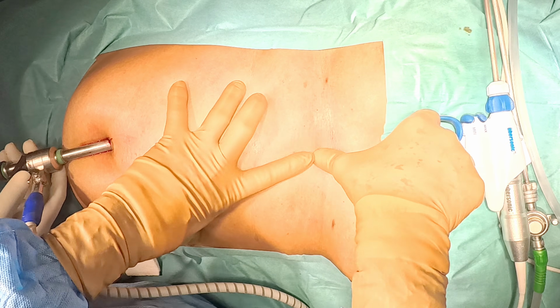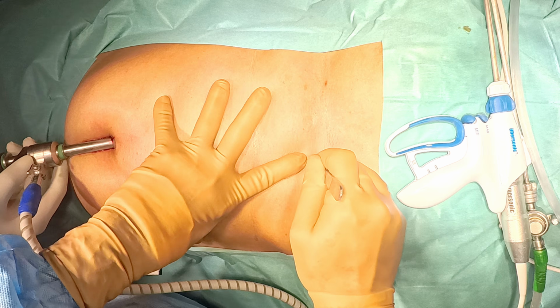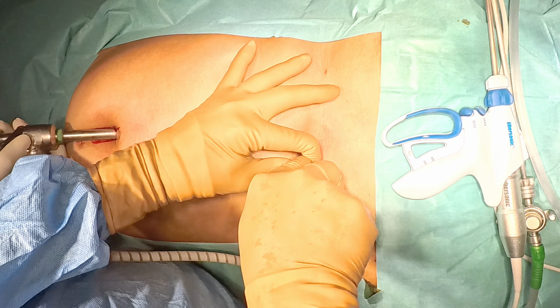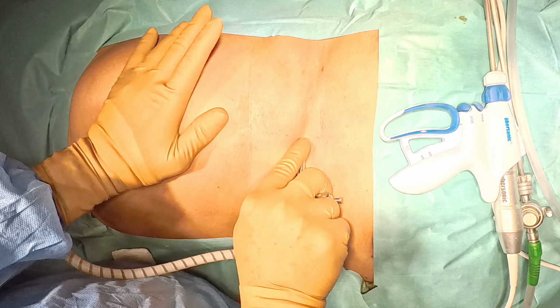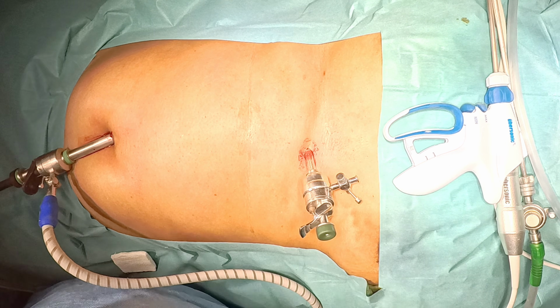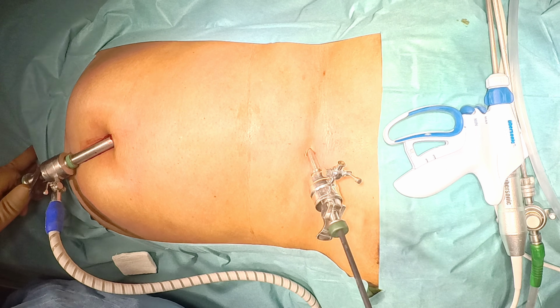So, this is the xiphisternum. Just below the xiphisternum, only a 5 millimeter incision will be given. This 5 mm port will be used for dissection and sealing of the cystic duct and cystic artery. And now we will give a small stab wound over the mid clavicular line, just below the costal margin, for the Stryker mini alligator.